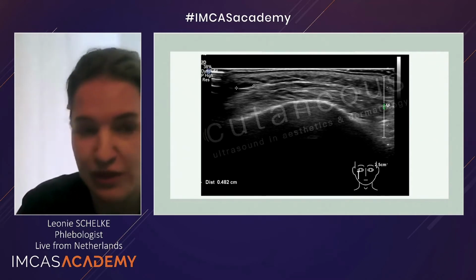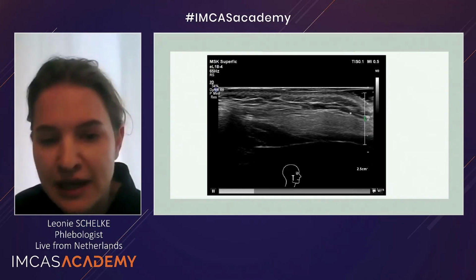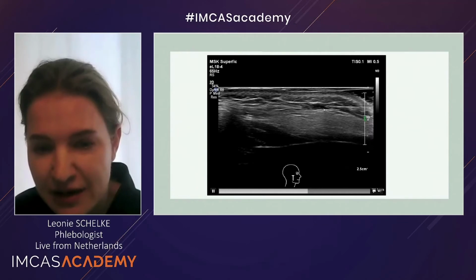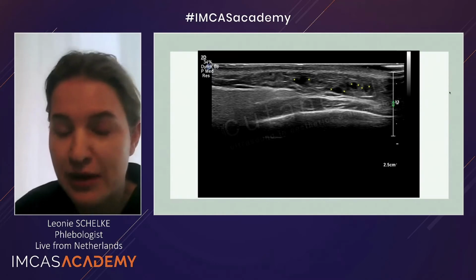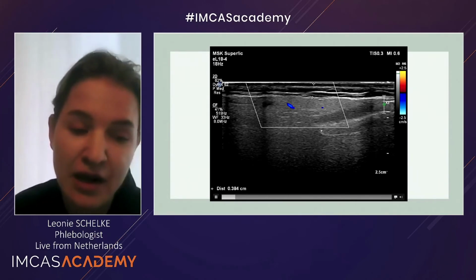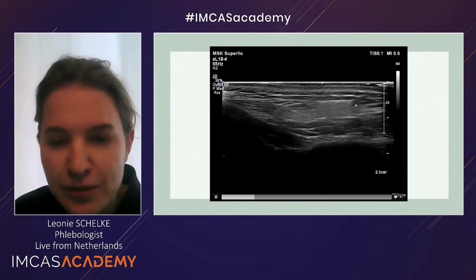So here again, parotid gland, my cannula is exactly in the subcutaneous layer, leaving some HA. And this is parotid gland muscle, epidermis, dermal, and the filler is placed correctly. But here's the opposite. And we do see a lot of filler being injected in the parotid gland. So there comes my needle, and your patient will not say, ow.